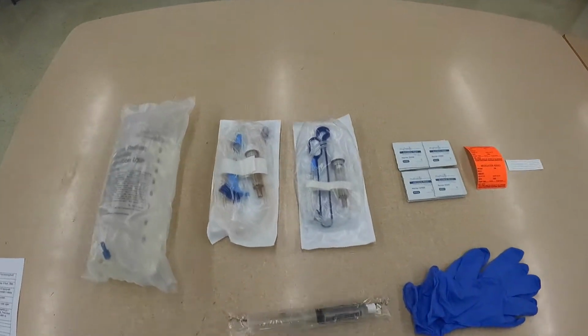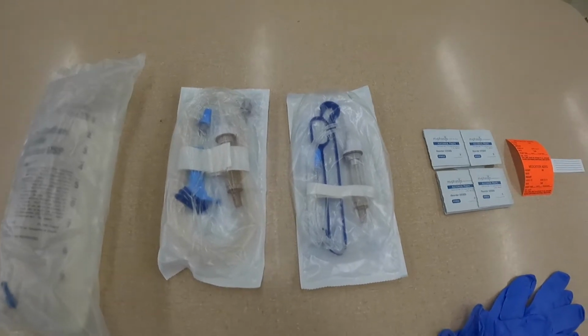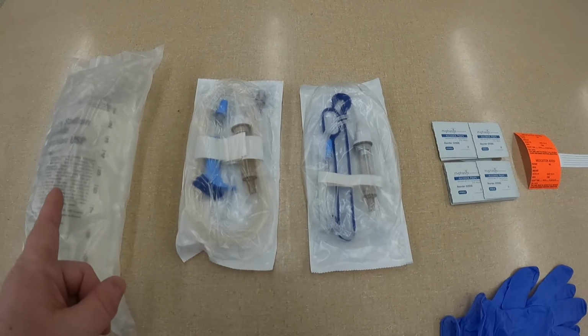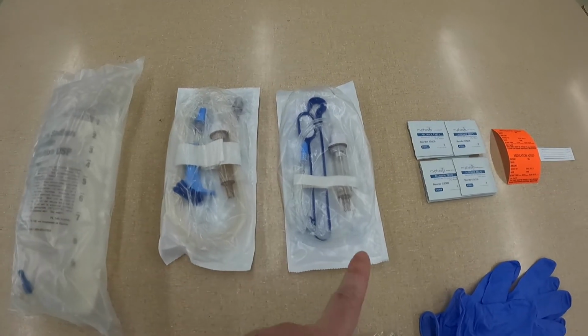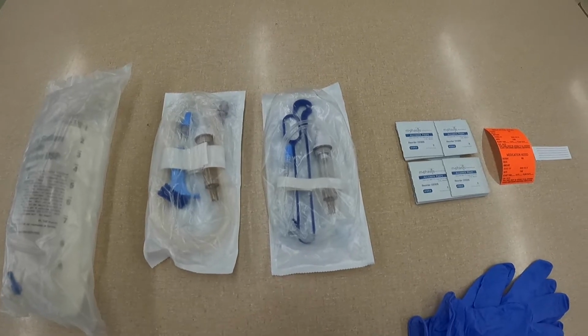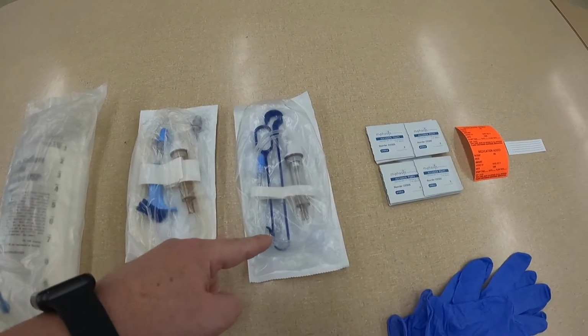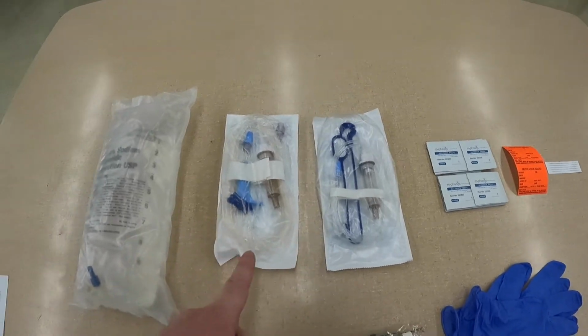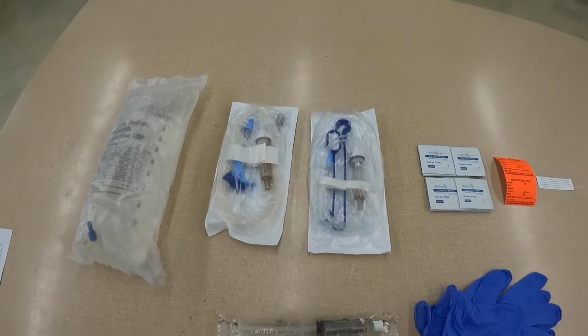The one on the left, this one right here, is the primary tubing, and that is what we're going to use today with our saline bag. This IV tubing you'll see in the stockroom as well, but it's for secondary tubing, and you can tell the difference because it has this blue hook in it. So we want to use the primary for our primary bags, and again, it does not have that blue hook.